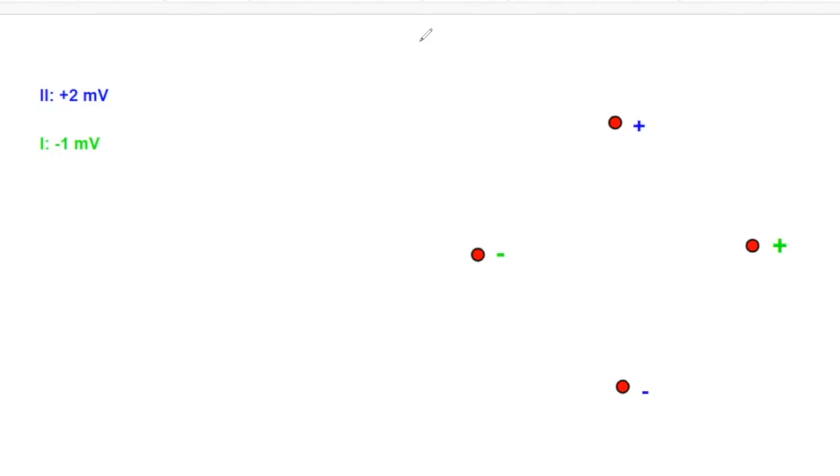Up and to the left. Let's do it one component at a time, so that we get an intuition for this. For lead 1, what direction is this facing on this lead 1 axis? To the left. It has magnitude 1. And then for lead 2, what is it doing?